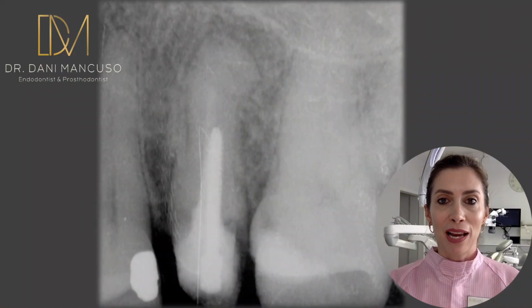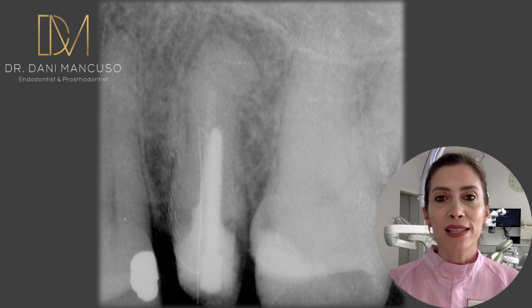Are you still thinking in two-dimensional? That's what we are going to discuss today. Stay with me. This upper left second premolar was referred to me, and as you can see there is a metal screw retained post with defective margins and defective root canal treatment. So what we are going to do is to check in the x-ray.